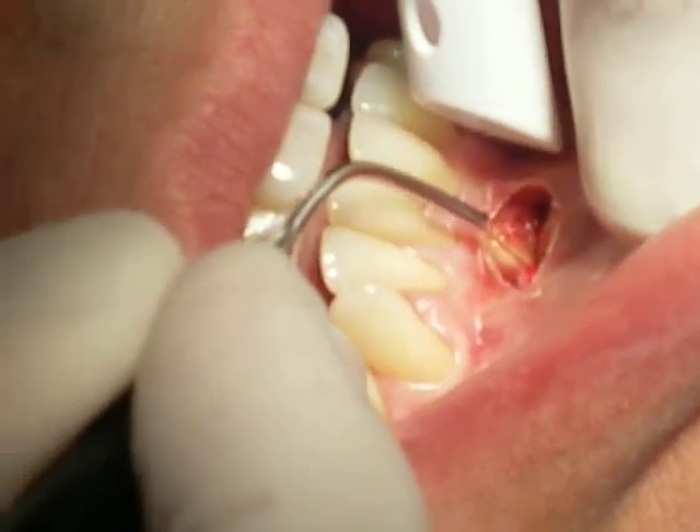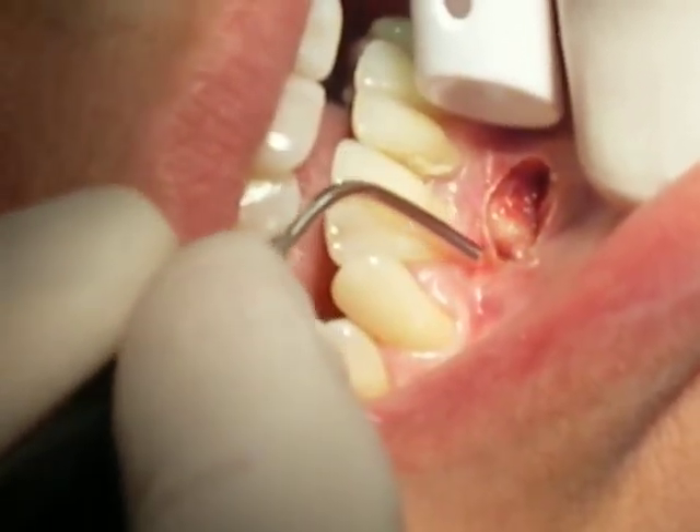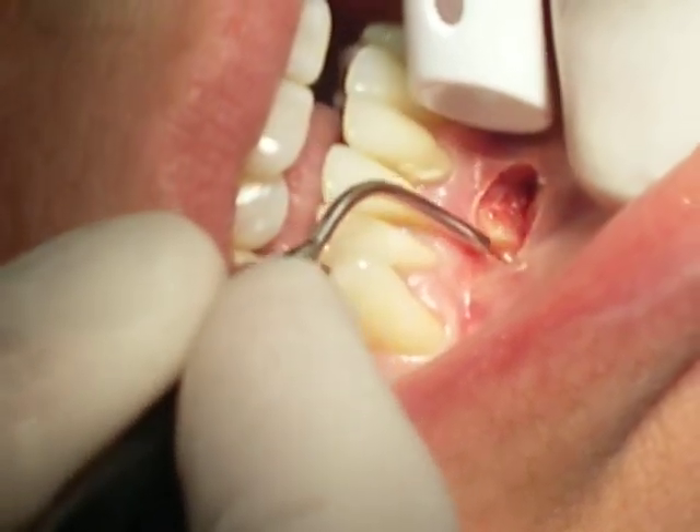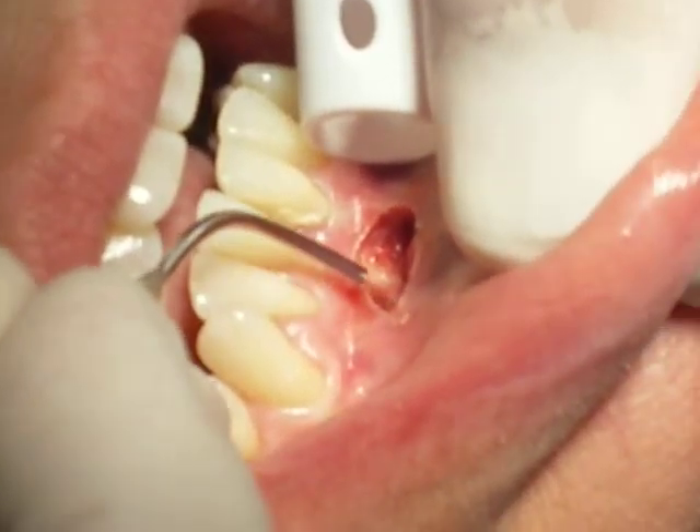We used to have to do this with a scalpel, but now we can do it all with this laser. The patient is going to feel much more comfortable with a lot less postoperative pain.